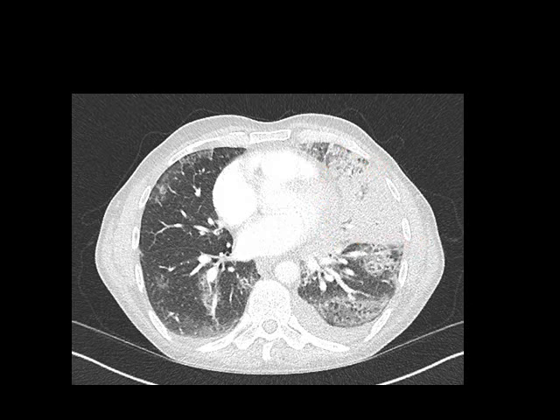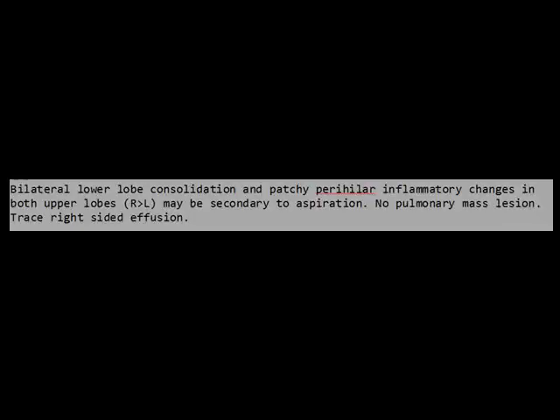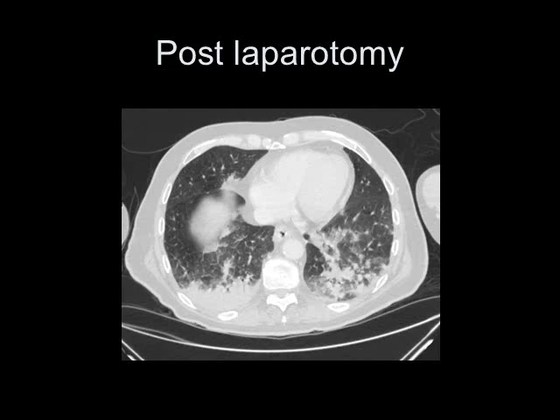Here's a patient with status epilepticus on a ventilator. I would certainly say this was an area of atelectasis — the volume seems to be lost. I would also call this atelectasis because of the position of the abnormality and the clustered nature of the air bronchograms, though I'm not a hundred percent sure. The report says 'bilateral lower lobe consolidation,' which I really don't think is correct — those are more in keeping with atelectatic changes.